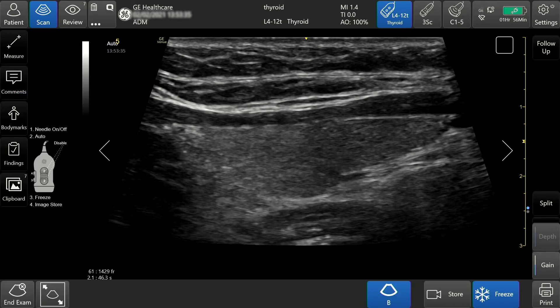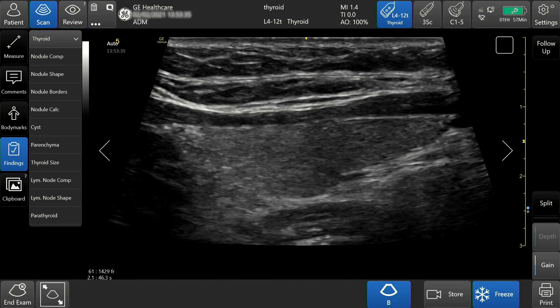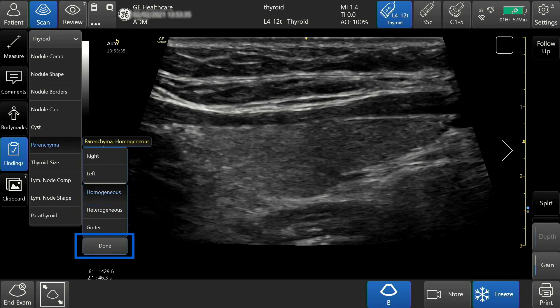To add findings, select the findings tab on the left hand side of the touch screen. Tap and select the findings from the list provided. In this case, I will select parenchyma and homogeneous. When you are complete, tap done.